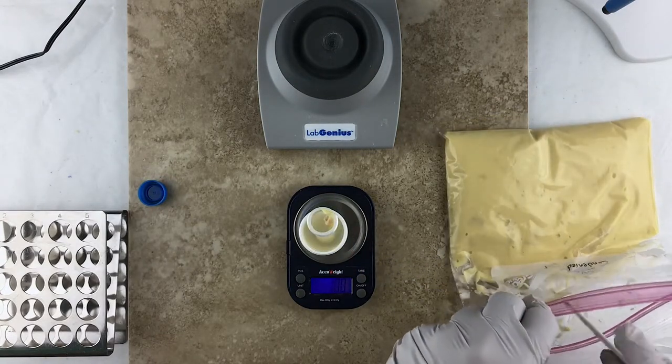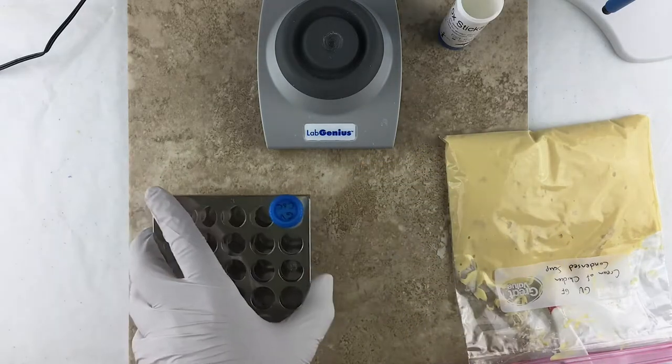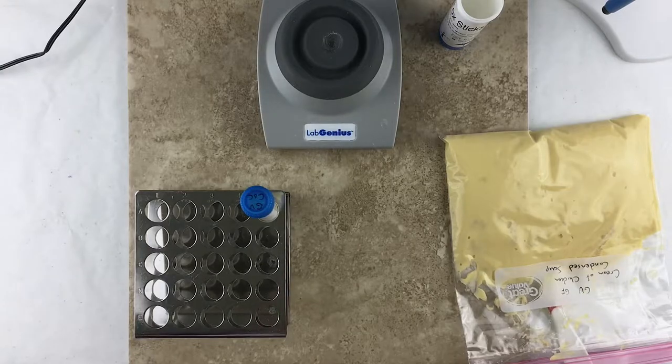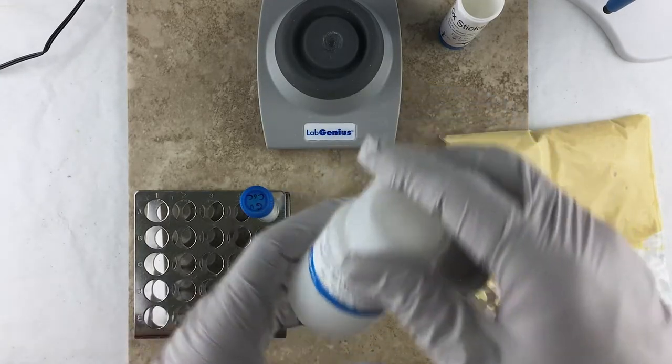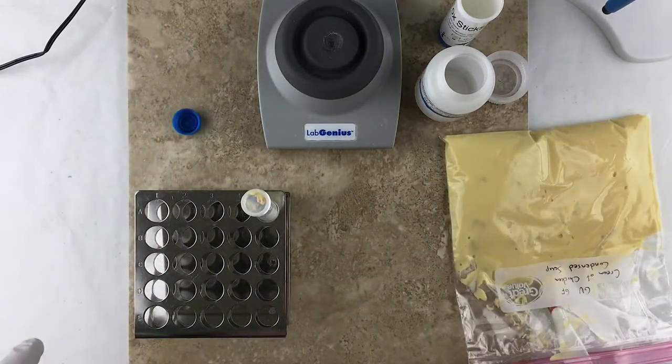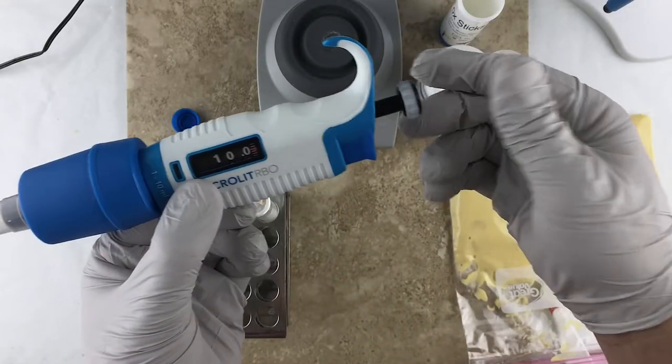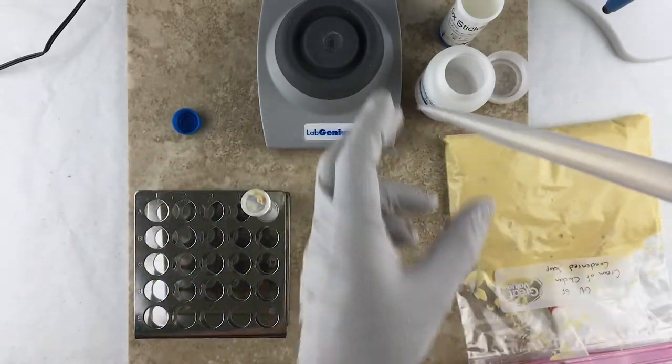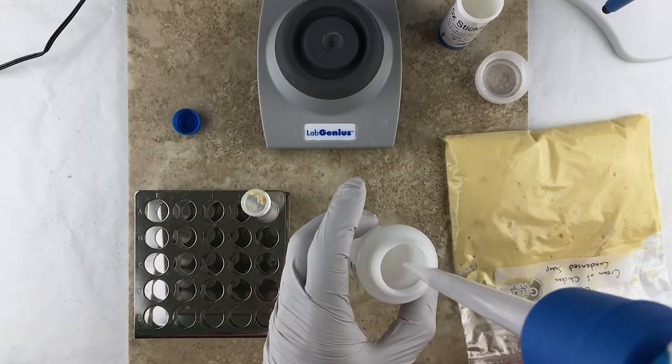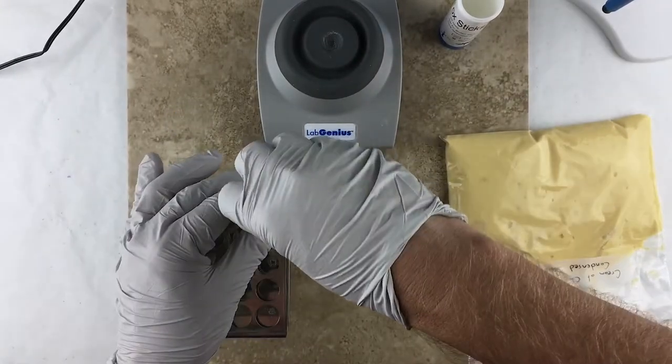Now we'll put one gram of the soup into it. Okay, there's one gram. I'm going to leave it right there. Now the next step is we need to take some extraction solution which we have here and we need to put 10 milliliters of the extraction solution into this vial. So I've got this pipette here set to 10 milliliters.